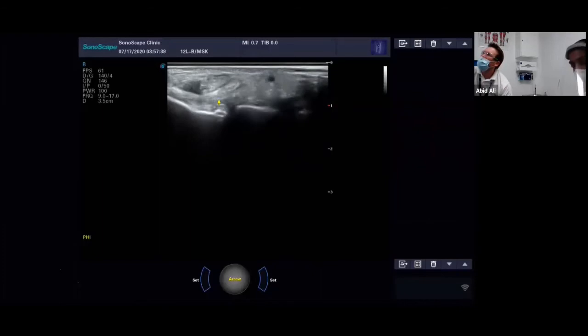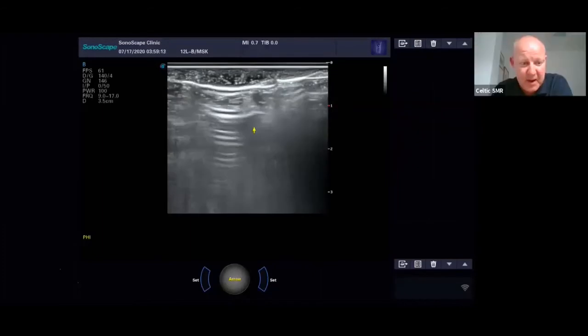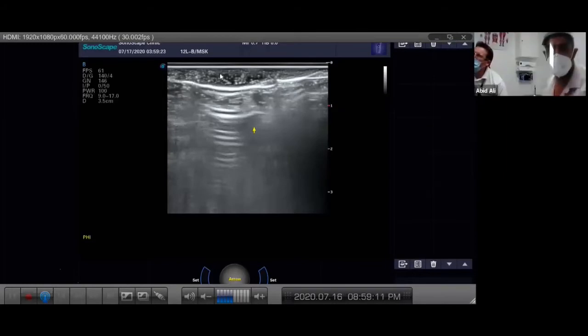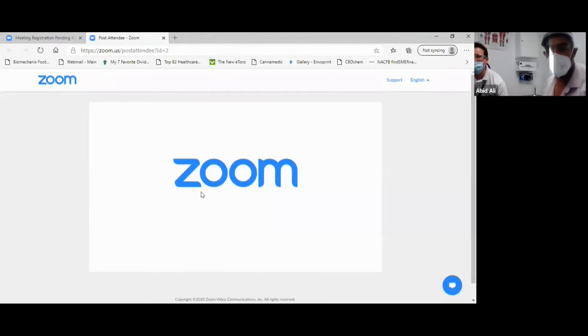So interesting stuff. Just got a question come in about the Doppler. Please, when you use the power Doppler, how do you know how much pressure and gain to apply? Well, the least amount of pressure, the better, because obviously if you apply pressure, you will squish whatever you're hoping to show as flow. So the least amount of pressure, the better.